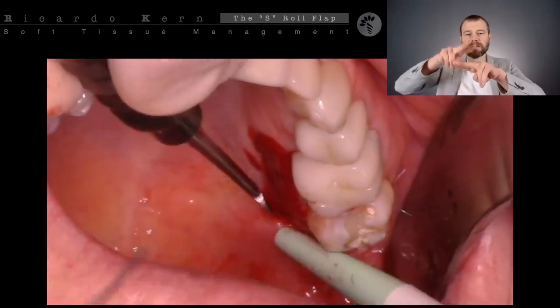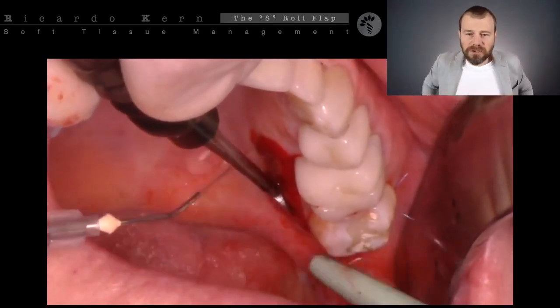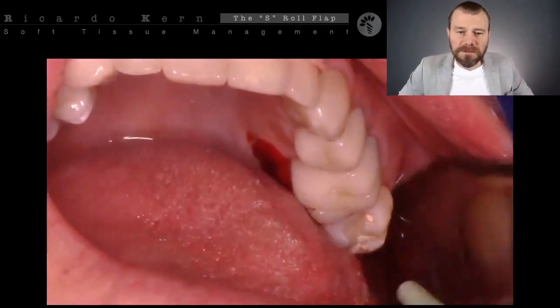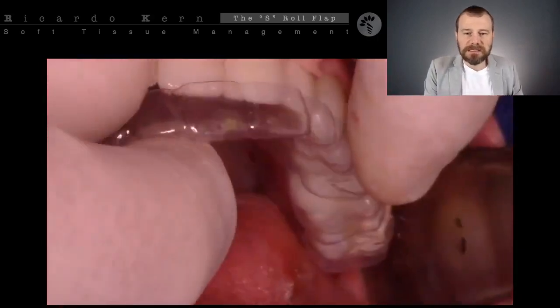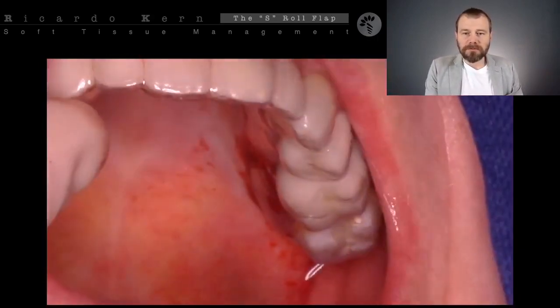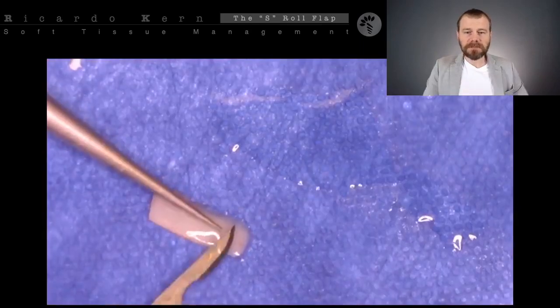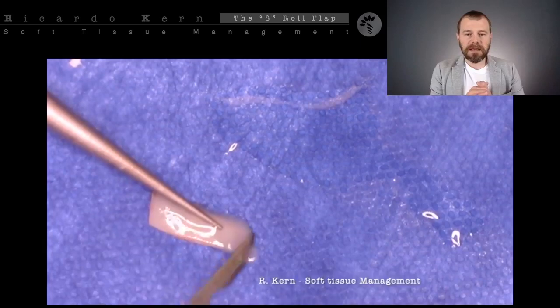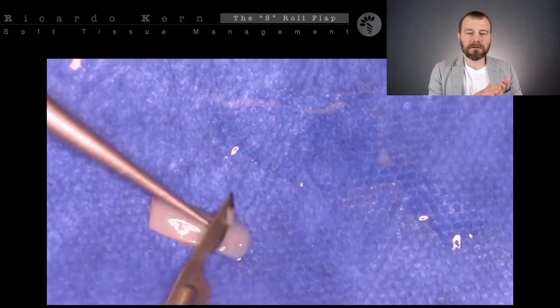It stays in a cross arrangement to hold the fleece in place, okay? Good, we have 6 minutes to finish this case. I think it's enough time for us to finish the video. So the deepithelialization, I prefer to do that by hand, outside the mouth of the patient.